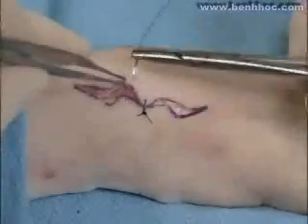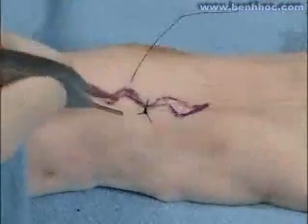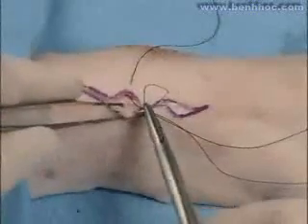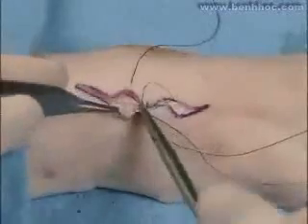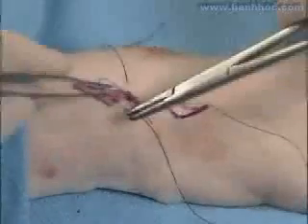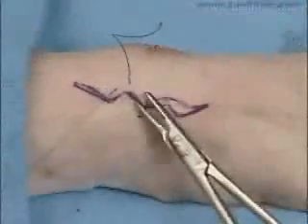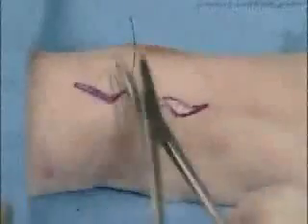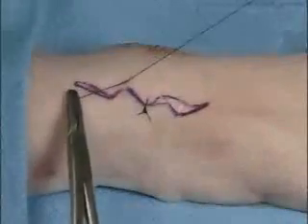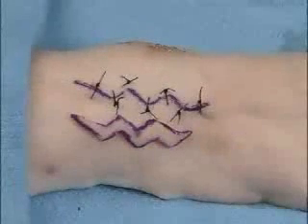Here the sutures are interrupted, again from a valley to a peak, or from a peak to a valley at the apex. Corner stitches may be used. Here's an example of a corner stitch being used at this site into the dermis to prevent tip necrosis. They are not necessary in every case. And now the second throw is through the skin, and the suture is then tied down to close the wound. Instrument tie certainly may be used, or a hand tie may be used. Always use square knots.